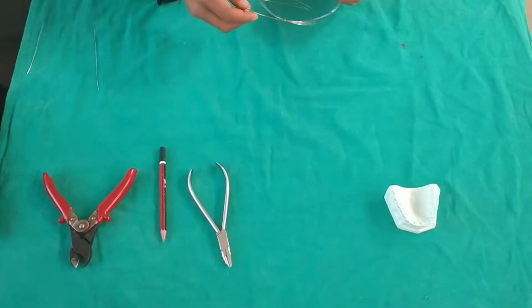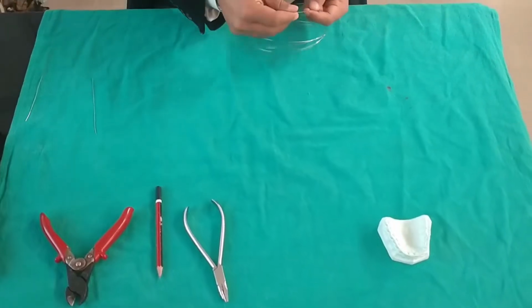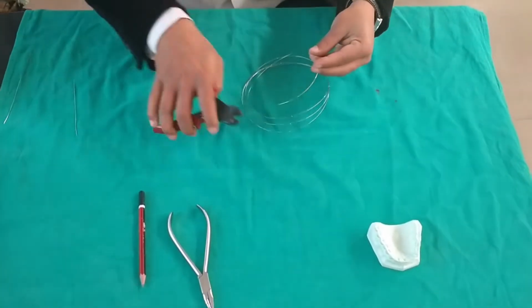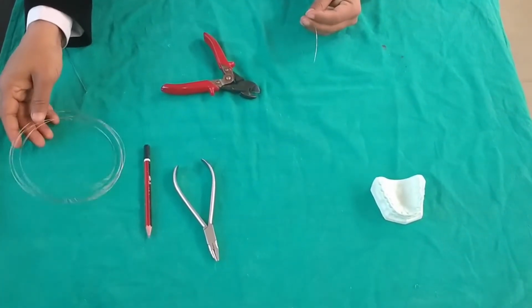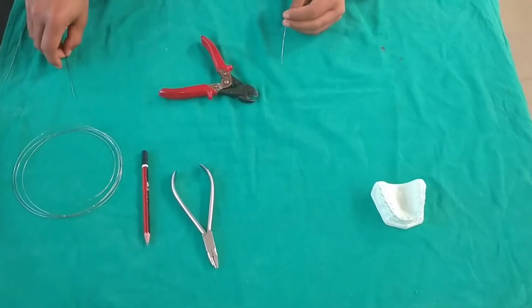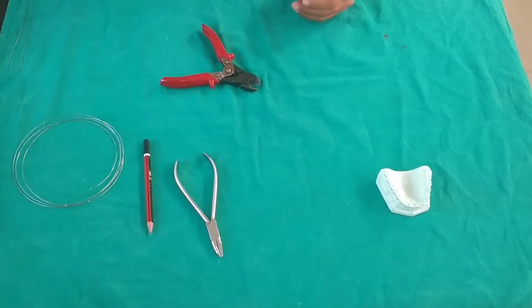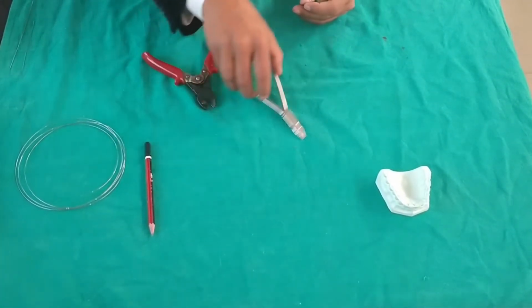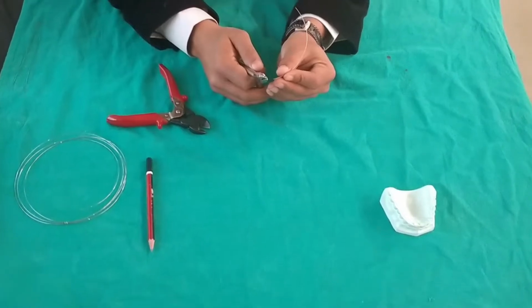We will learn how to make canine retractors. Canine retractors are the appliances which are used to retract the canine. These can be buccal or palatal, can be pull type or push type. Some are with U-loop and some are with Helix incorporated. In this video, we will make a palatal canine retractor.